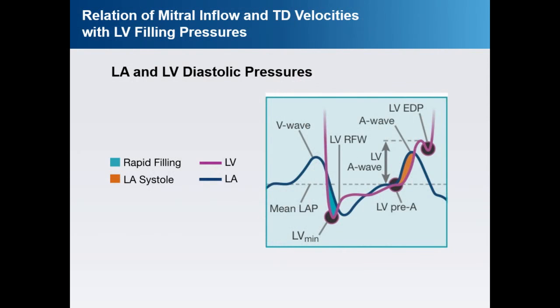So many of you are familiar with the topic of diastolic function. Diastolic function, strictly speaking, is a lot of things that can be assessed. It was described first invasively, looking at the rate of LV pressure decline during the isovolumic relaxation period. It's looked at also as the rate of rise of LV pressure with respect to filling, how fast the pressure rises as filling of the ventricle takes place during diastole. And it is possible to derive variables, but you need high fidelity pressure catheters to do that.